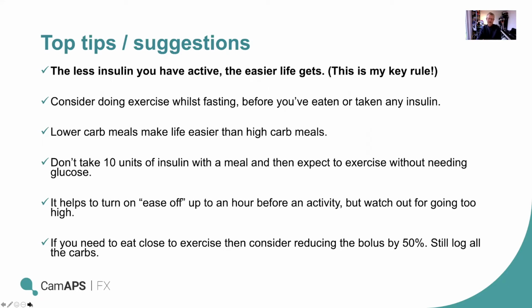I'm a big fan of exercise while fasting, particularly the time in the morning before I've eaten or had a bolus. It's a great time to exercise and keep things simple. I know some people can be a bit skeptical about exercising without having had any food. I'd say for me, it's fine. I ran the London Marathon fasting. I wasn't using closed loop. I couldn't have done that if I'd had to bolus for breakfast. It would have been impossible.